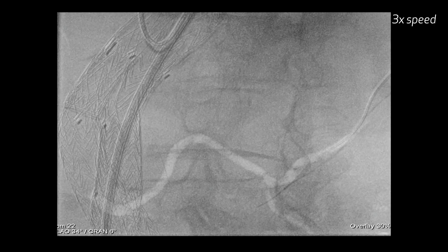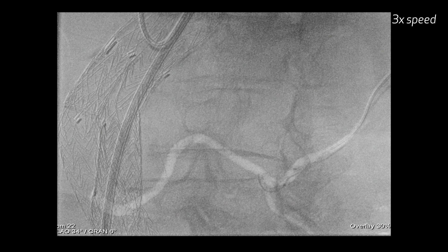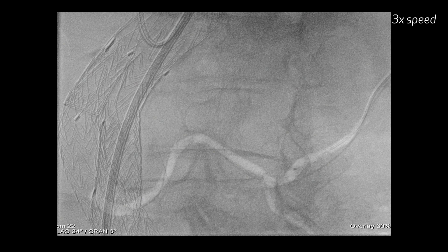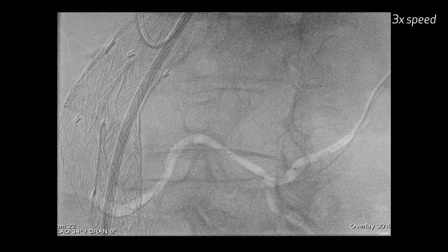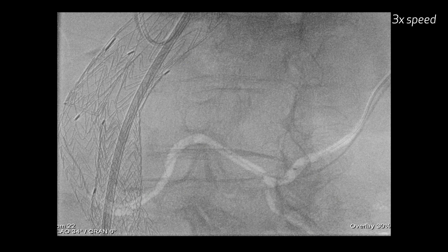As you can see, it's a little tricky at this point. But overall, you can see it's going down a side branch there, and we've turned the roadmap overlay back on, and now we're actually off and running and heading towards the aneurysm. The wire is now being followed. You can see the little radiopaque marker on the tip of the microcatheter — that's what we're using here. And once you get beyond that last sigmoid branch, it usually goes right up into the aneurysm sac itself.